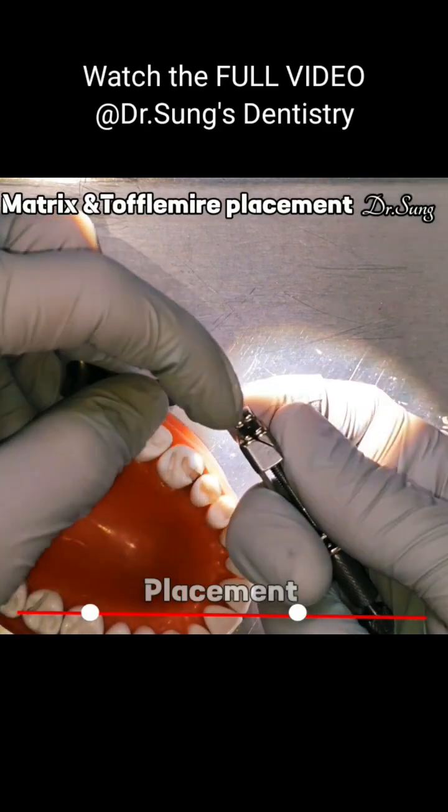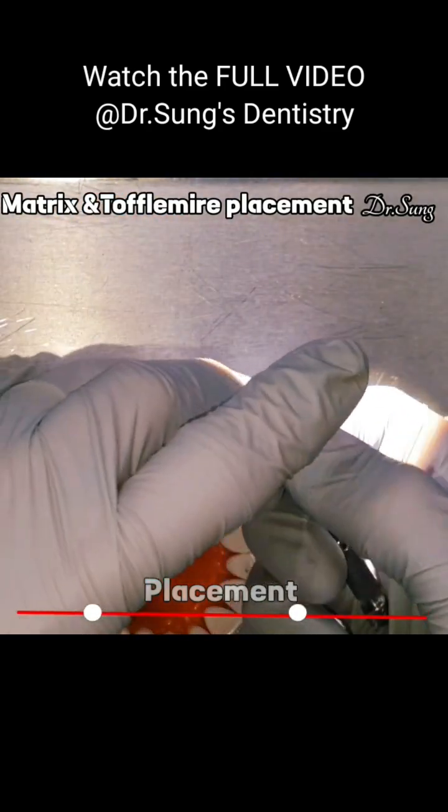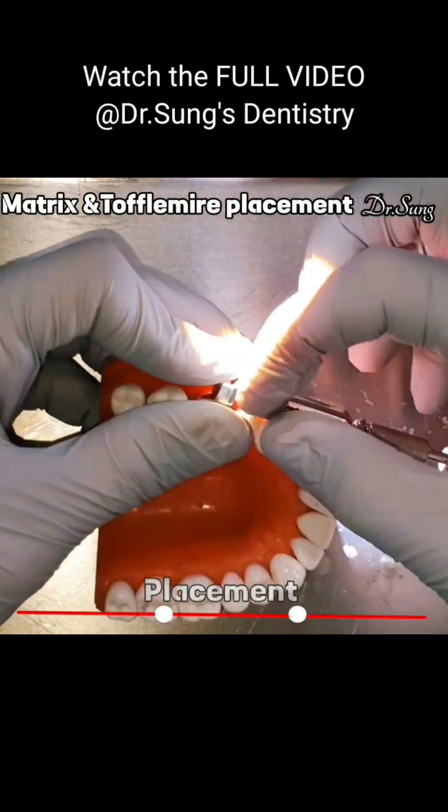There are three slots. So since we are working on this side, we are going to place it here. And the more you do it, it'll tighten.